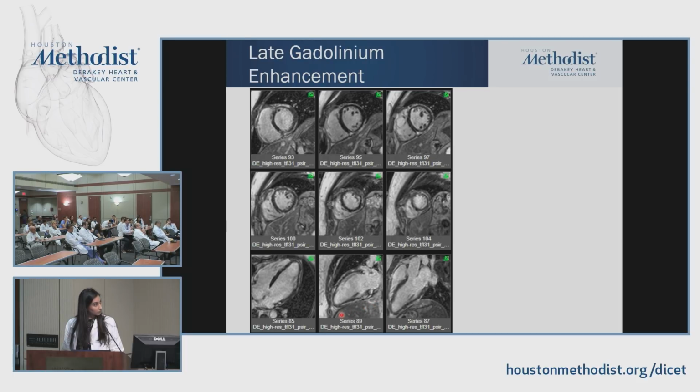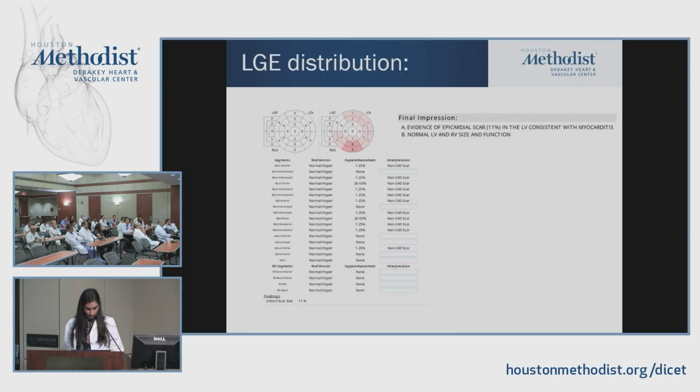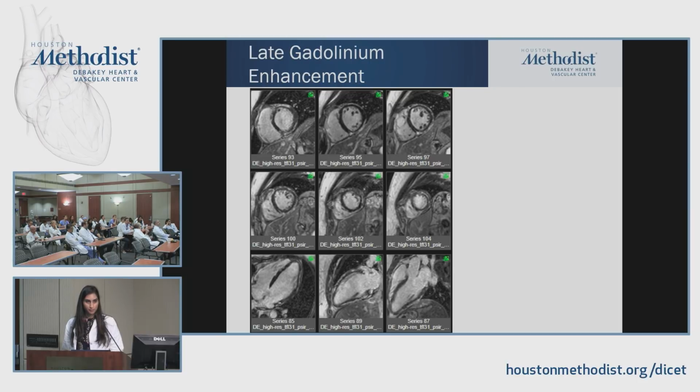And when I look at the short axis, it looks like it's there as well, from base to mid and even a little bit in the apical region. Also subepicardial. Right. So both the anterior wall as well as the inferolateral wall. You can even see some at the RV insertion site. If you look at those two views right there. And again, all of these are epicardial-based patterns of enhancement. So again, this is not what you would expect with coronary artery disease, right? So this looks like a pattern that you would expect to see with non-ischemic myocardial injury.